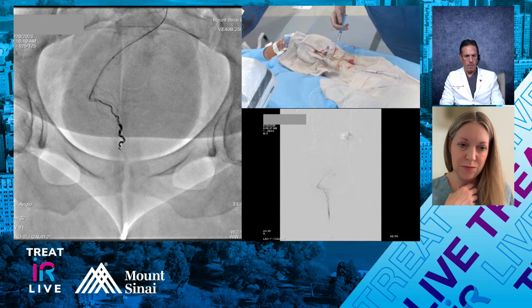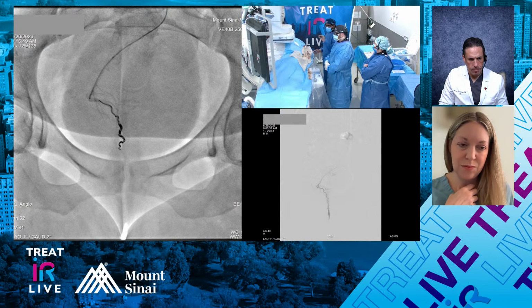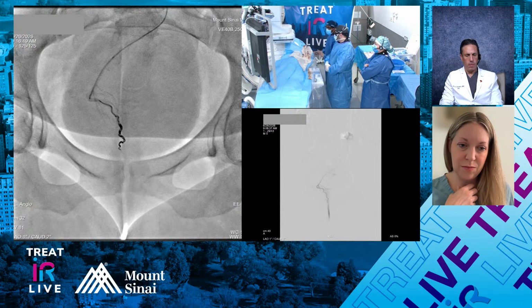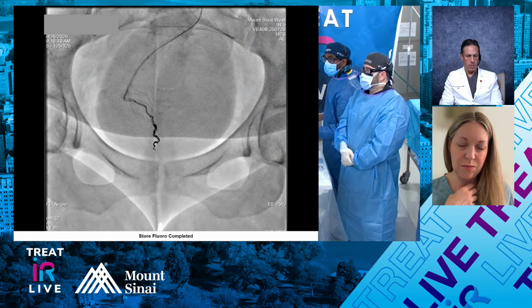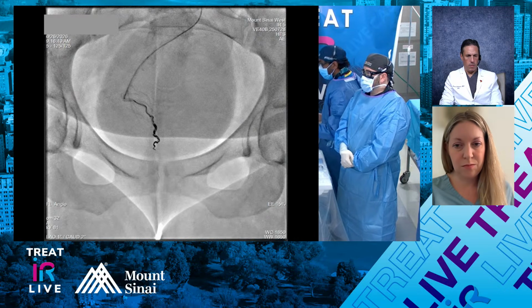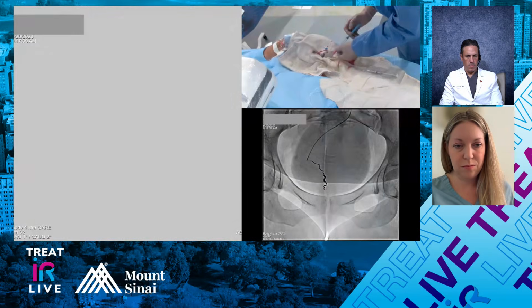Aaron, I want to interrupt you for one second. There was a little tail on that coil, and when I pulled the microcatheter back, it was already detached, but the tail came up a little bit. These vessels sometimes are very sensitive with these coils. If that was a fibered coil, it would have come back a lot more. So if you are going to use some of these coils, the soft one is kind of like a protective mechanism. I'm going to do a run right now, and you'll see that it occludes.